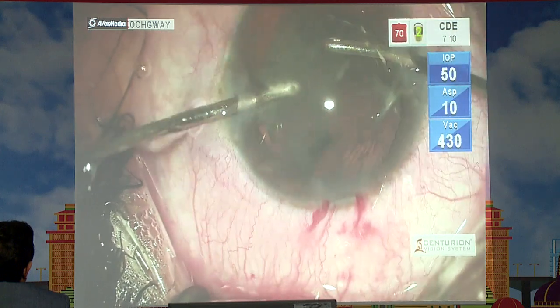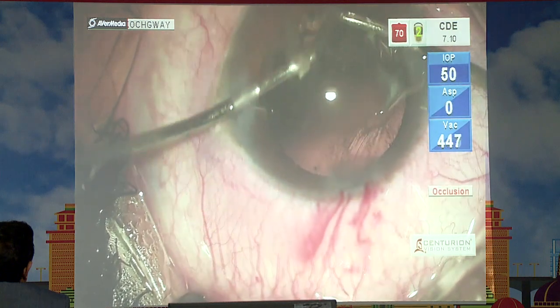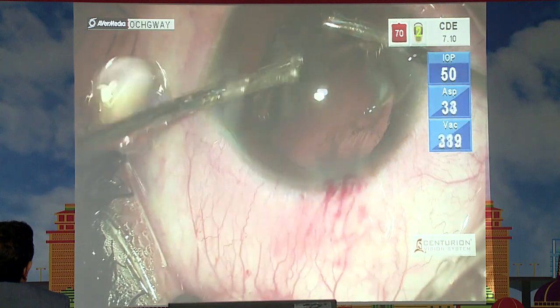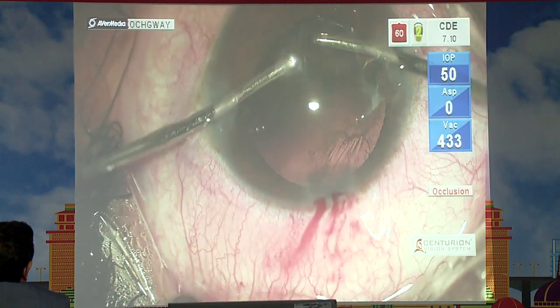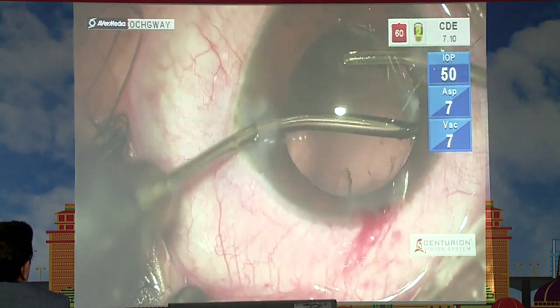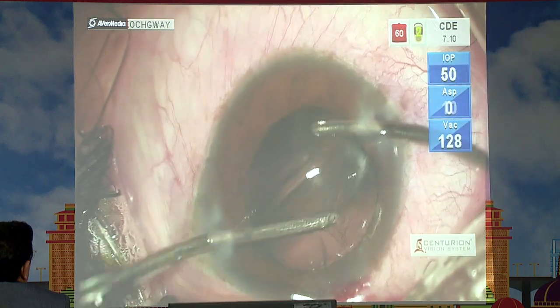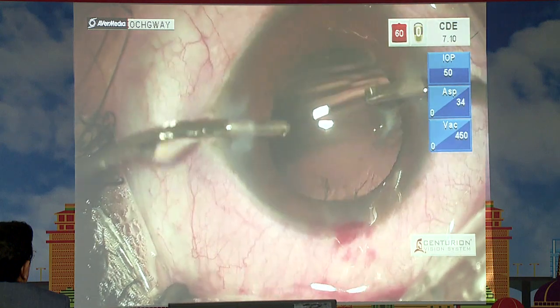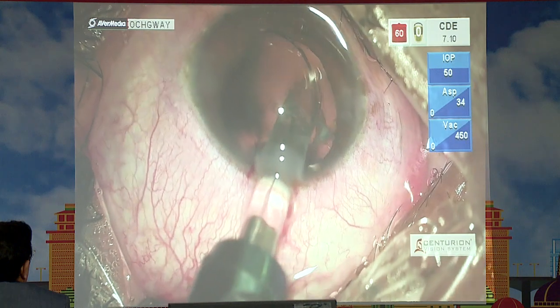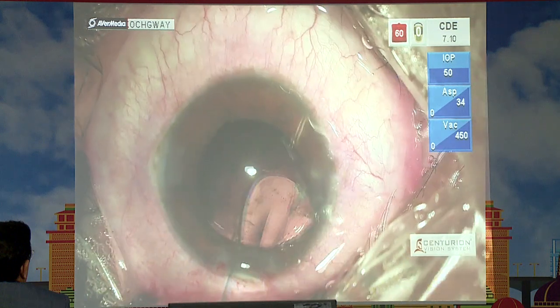So while doing the cortical aspiration, till now all going fine. And we are taking care not to decompress it because of the lesson learned from the last case. But still, with all precautions, posterior polar cataract may sometimes give way, and our aim is no vitreous loss. So here you can see a linear PC tear has occurred, and so the lens has been placed in the bag.